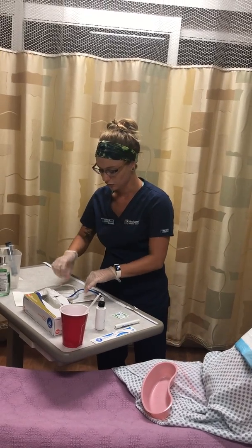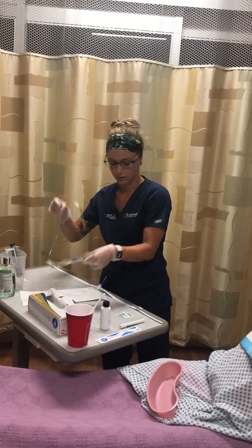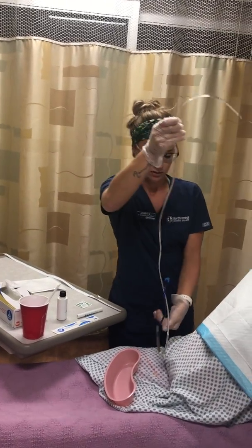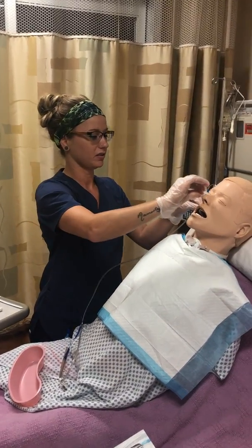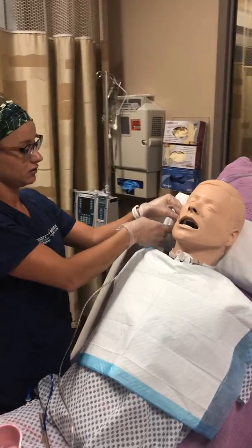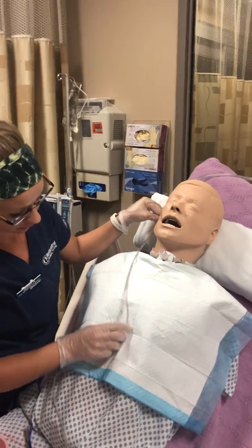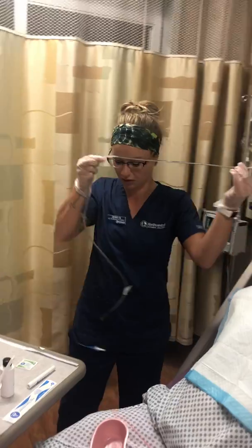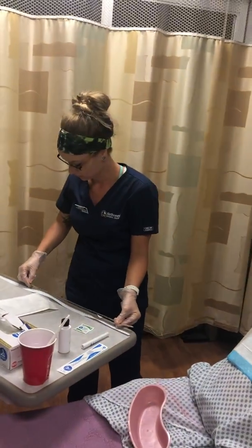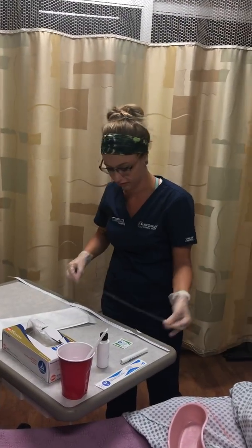And what I want to do is grab my NG tube and measure from my patient's nose to their ear and then down to their xiphoid process. And I'm getting about 50 centimeters. I can also compare that to my measuring tape, and that matches at 50 centimeters.